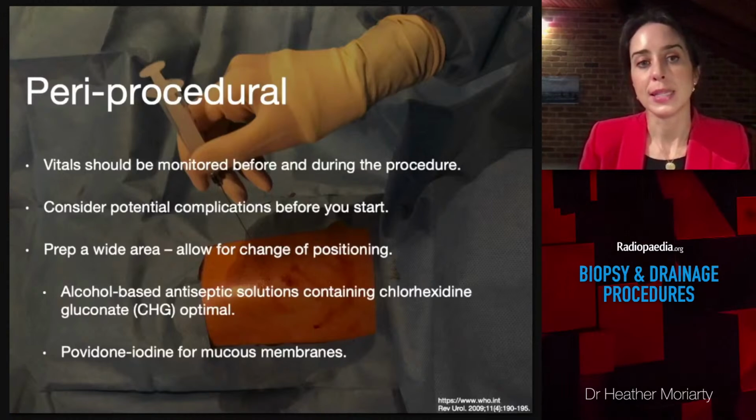Aqueous-based solutions like betadine are one of the few products that can be safely used on mucous membrane surfaces. Otherwise, chlorhexidine solutions are ideal.